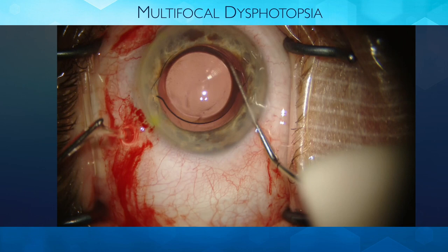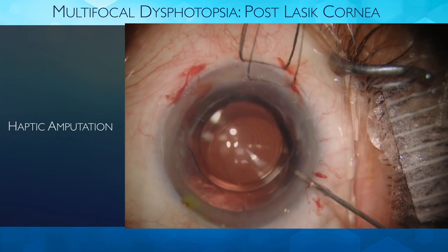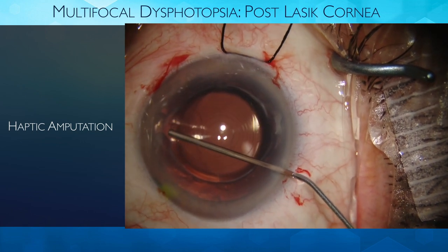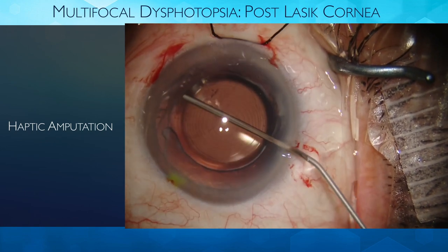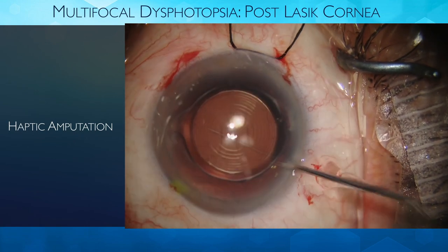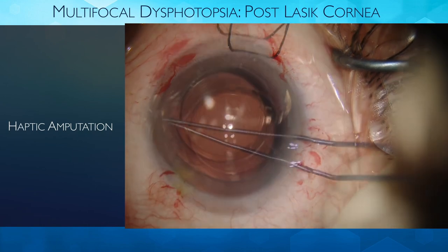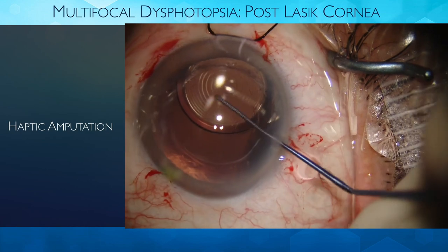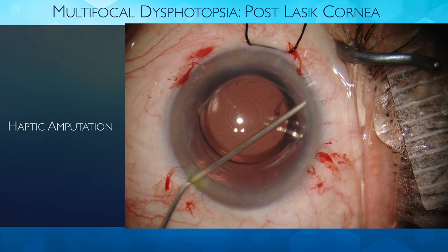That came out very easily because this patient was only four weeks post-op. Now let's look at a patient who was post-LASIK, had a multifocal placed, and had multifocal dysphotopsia. Once again, we're going to visco-dissect down the optic-haptic junction and assess how fibrotic the anterior capsule is. With Tecnis lenses, the capsule gets hung up at the optic-haptic junction, whereas with Alcon lenses it's at the terminal bulb. When rotating, be careful — you can affect the zonule. Pulling up rather than rotating is critical.